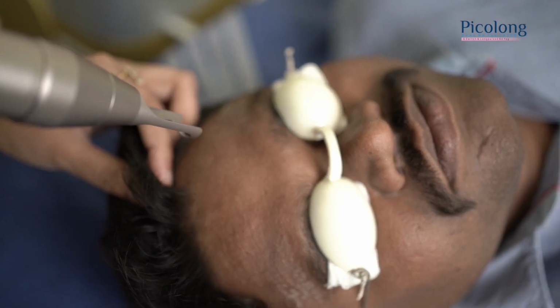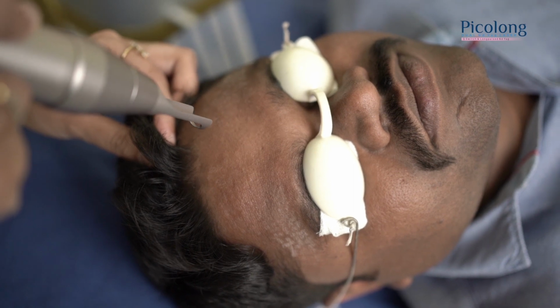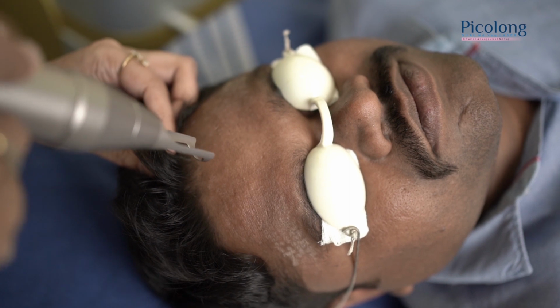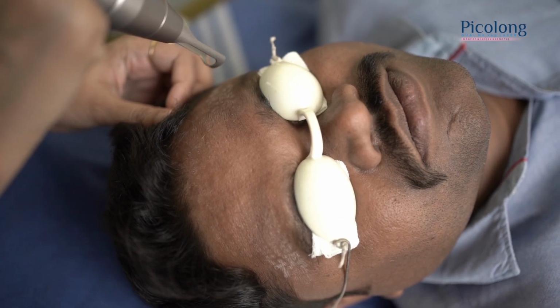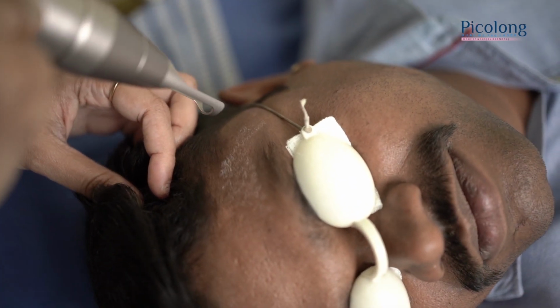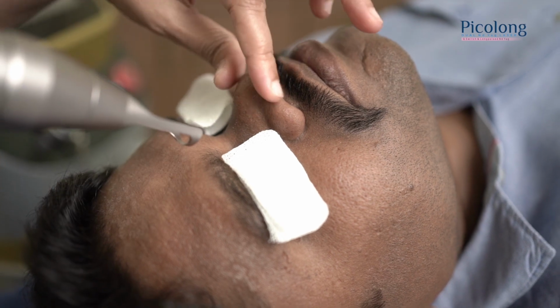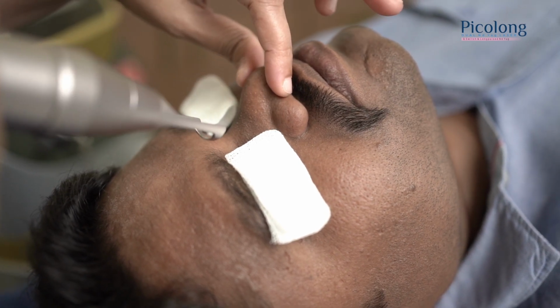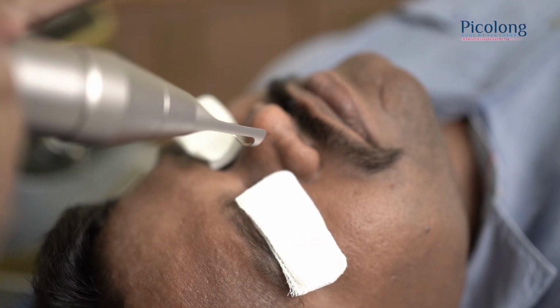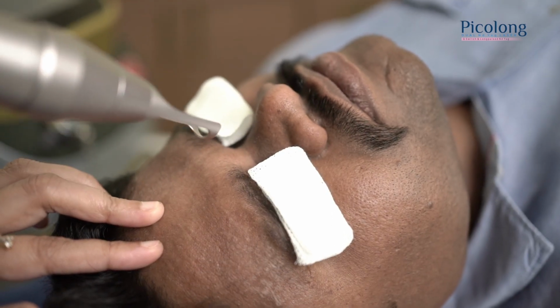The results are seen after 2 to 3 weeks, and a minimum of at least 3 to 4 sittings of these at an interval of 1 to 1.5 months is required. Make sure if you're using a high energy, please do not repeat the areas. So now I'm working on his nose, wherein it's a little hyperpigmented area. I'm keeping my spot size a little higher. The patient should be feeling the heat. If the patient is uncomfortable, that means you have reached the maximum energy.